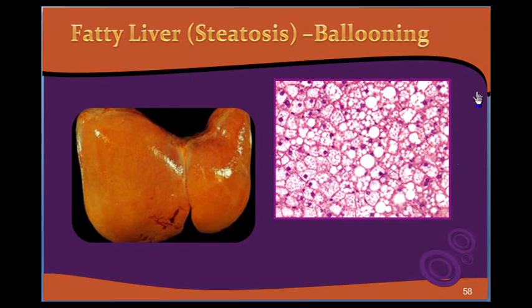This slide shows the fatty liver. Look at the altered color of the liver. The red looking liver has turned orange red or yellowish because of the deposition of fat. It is enlarged compared to the normal liver. Even the right lobe shows much enlargement due to the fat deposition. Your liver architecture histologically is replaced. Hepatocytes show accumulation of fat within each of the hepatocytes.